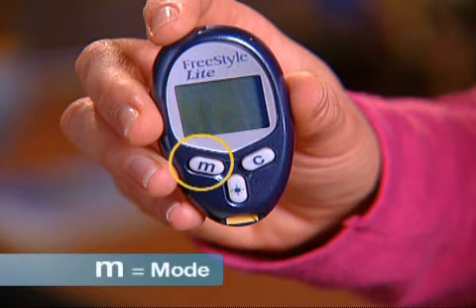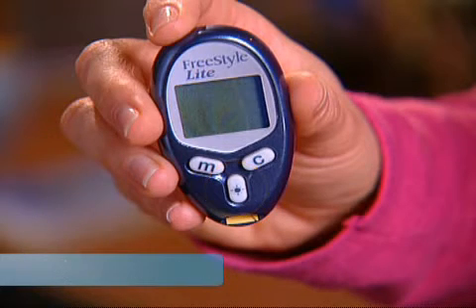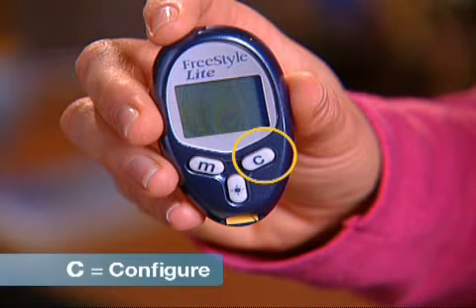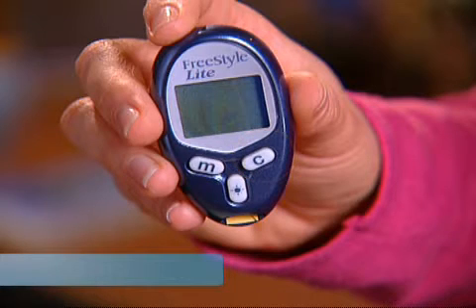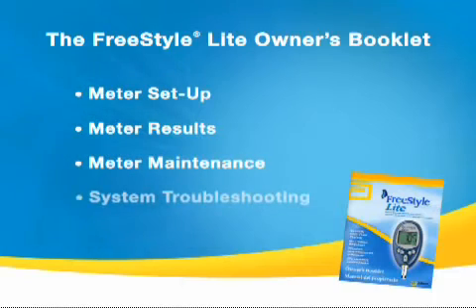The FreeStyle Light Meter is small and yet has a large, high-contrast display screen for easy on-the-go testing. The Mode or M button allows you to move to different mode settings, scroll backwards, and silence the reminder alarm. The Light button controls the display backlight and test strip port light. The Data Port allows you to download test results to a computer program. The Configure or Change C button allows you to scroll forward to display the clock. The test strip port at the bottom is where you insert the test strip. Several of the features have additional capabilities, so be sure to consult the Owner's Booklet sections on Meter Setup, Meter Results, Meter Maintenance, and System Troubleshooting.